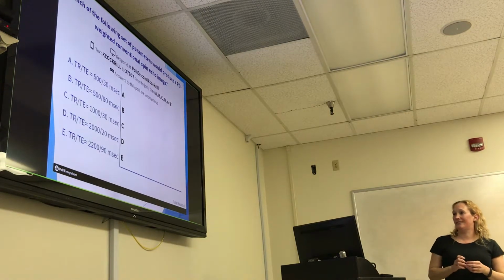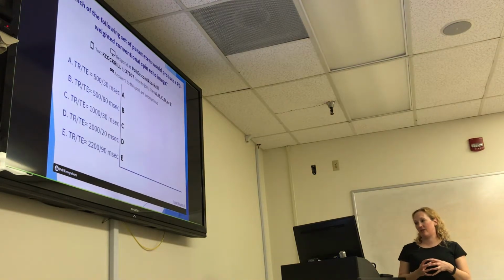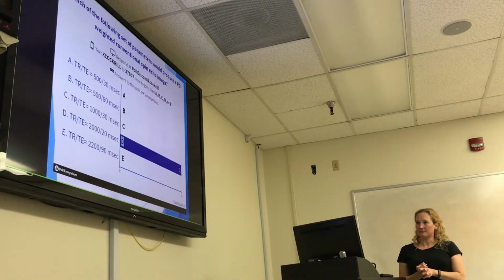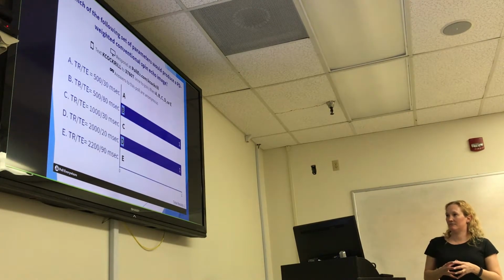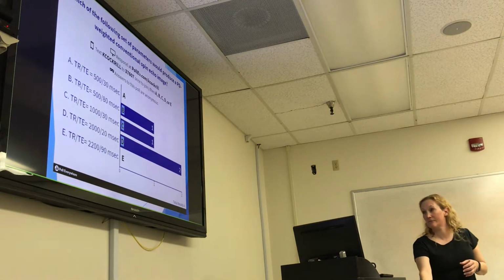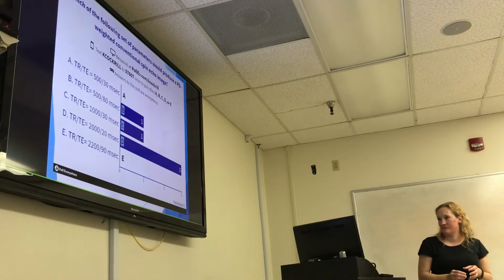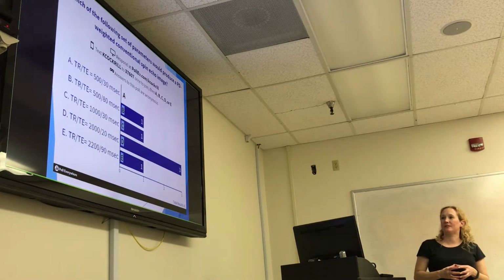All right, last poll of the day. Which of these would have produced the PD weighted? So again, ask yourself which one I need long and which one I need short or long, and then figure out from there. We're all over the map here.